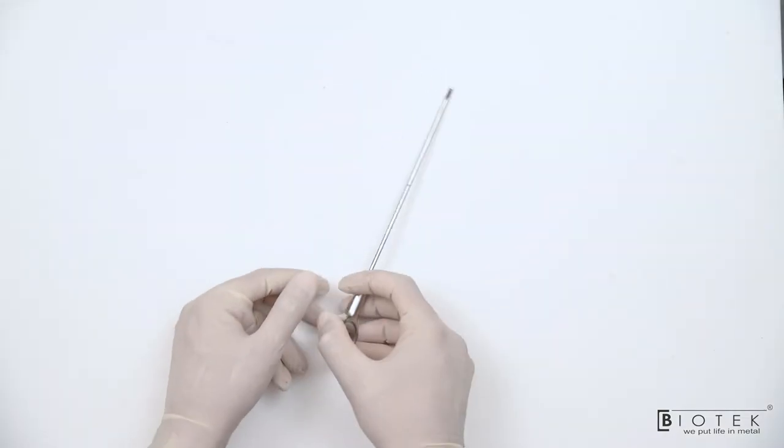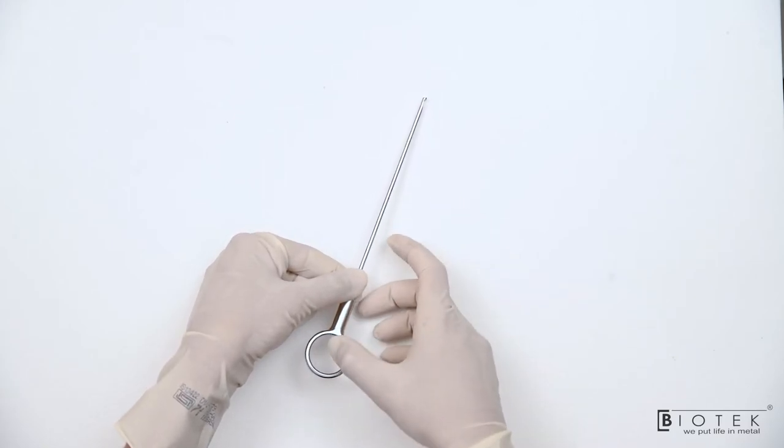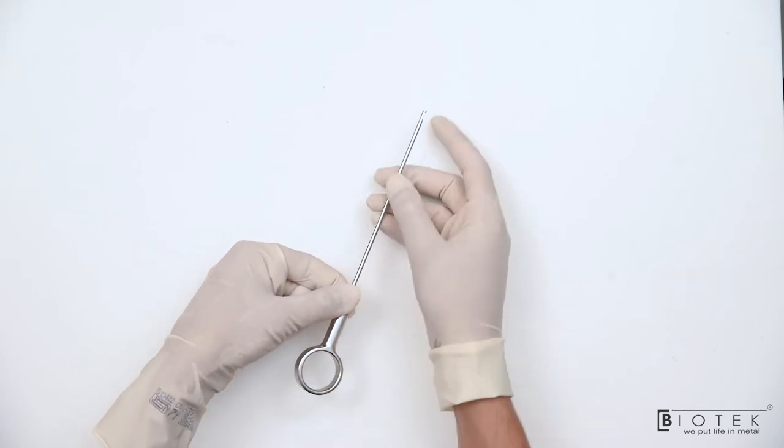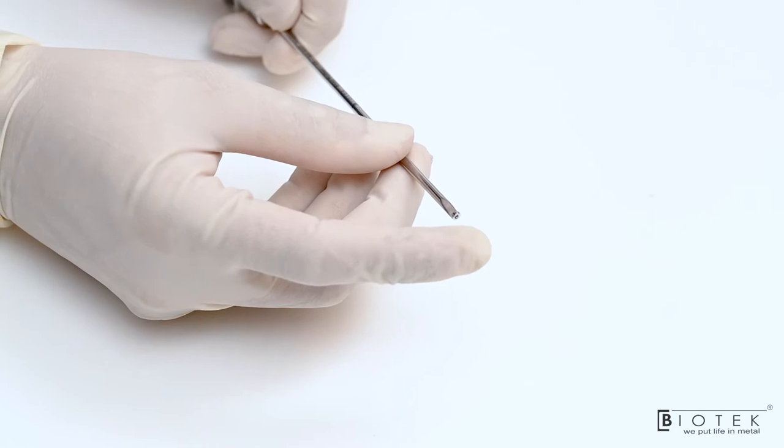This is knot pusher device. It is used to pass sliding or locking sutures. This is for the thumb and the tip is blunt. If tip is sharp it can damage the suture material.